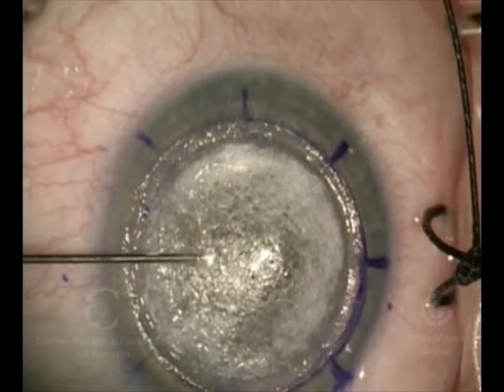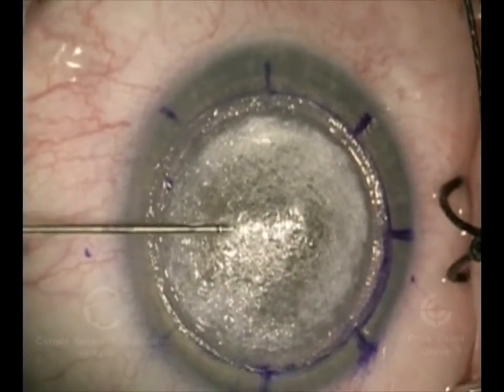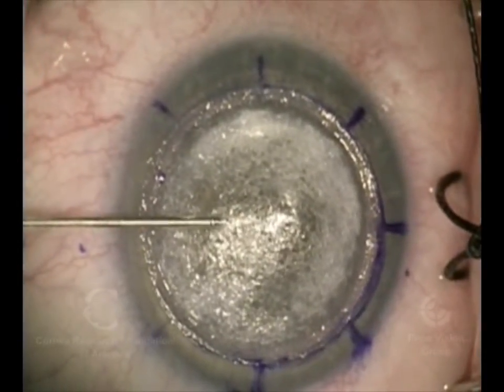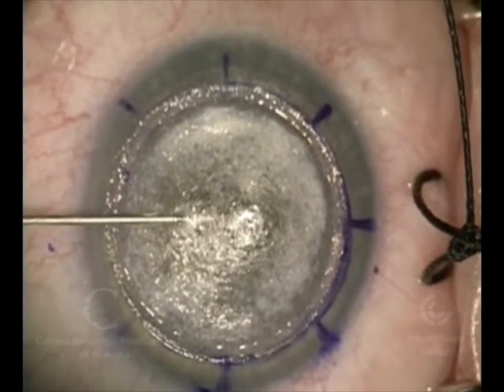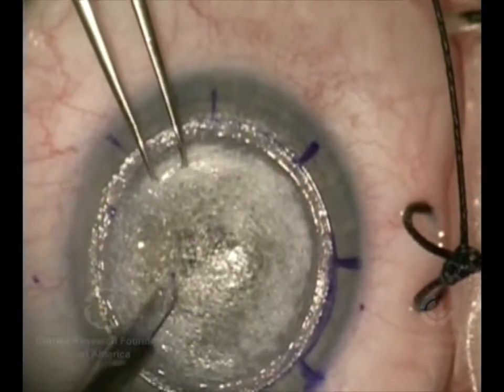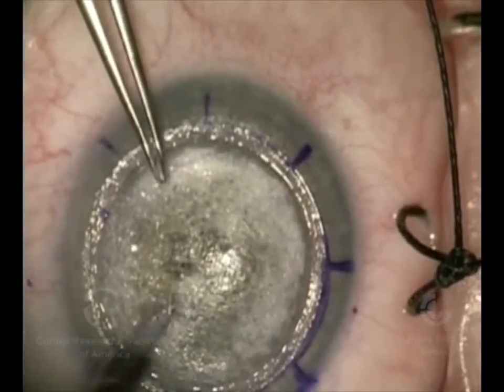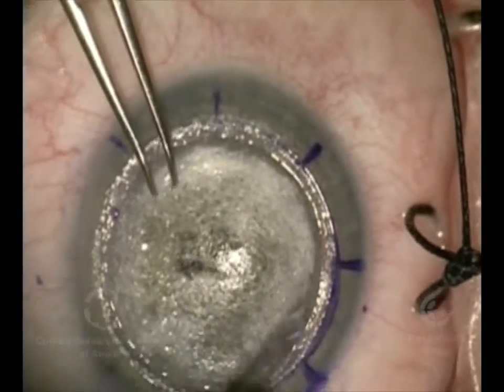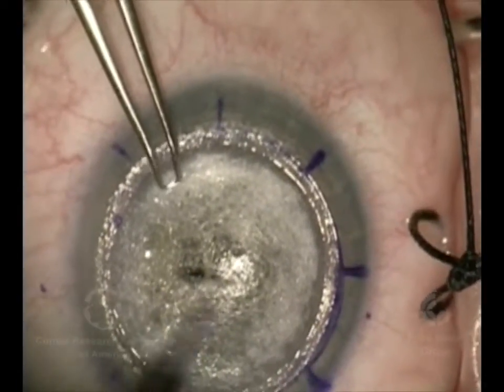Here we're going to inject a small needle and, inside of the bubble, inject a viscous material called viscoelastic. We use this inside of the eye to maintain shape because it's thick, or to protect the inner layers of the cornea. We're doing it here so that when we make this incision into the bubble, the thin membrane doesn't come up too quickly and become ruptured or cut by the blade.